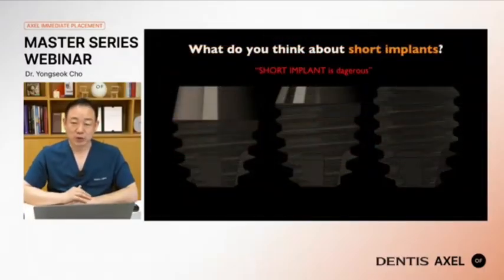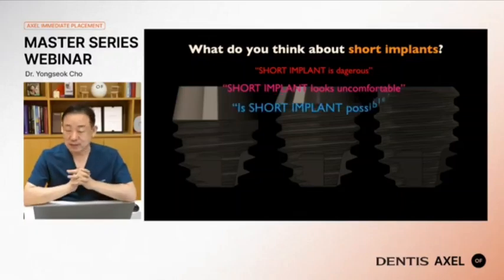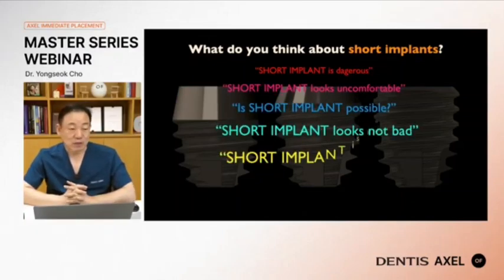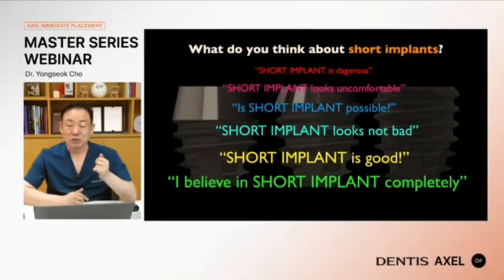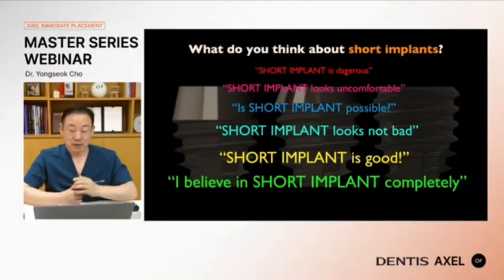What do you think about the short implant? In the past, like many other dentists, I was skeptical and uneasy about using short implant. However, my perspective gradually changed with increasing clinical experiences, and today I have complete confidence in short implant.